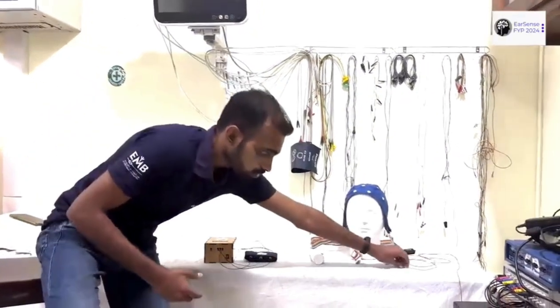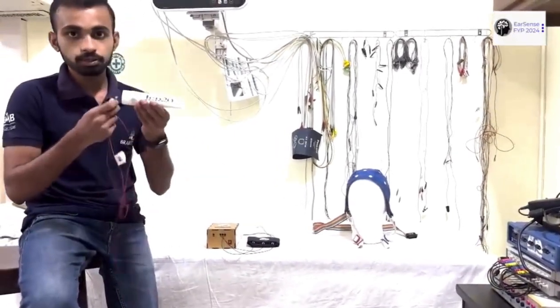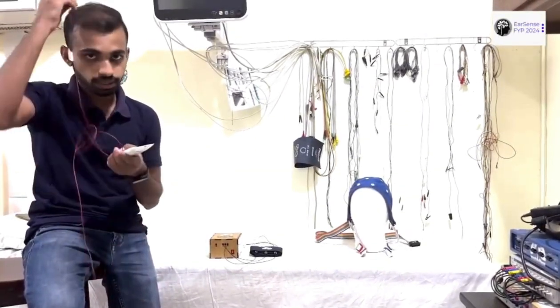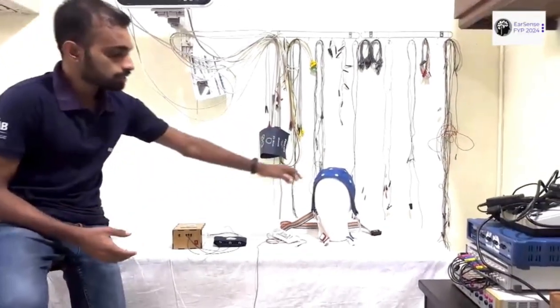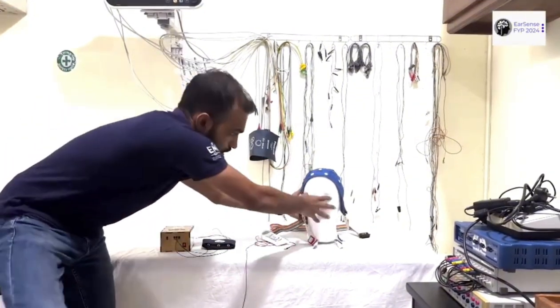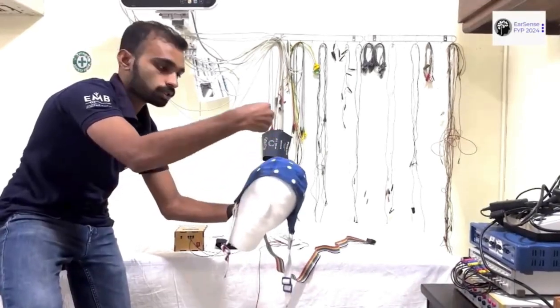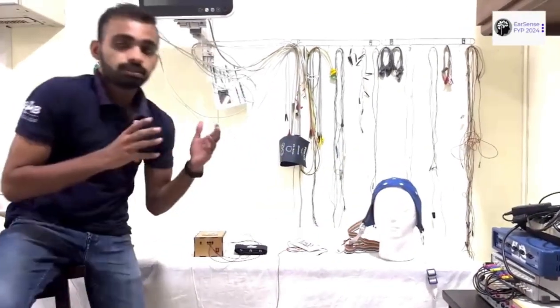Currently, EEG acquisition setups are very bulky. With a normal EEG setup, you have to use electrodes and apply conductive paste to them, so that you can establish a connection between the electrodes and the head. It is very hard to do, and people also use EEG caps to capture EEG signals. These caps also have a lot of electrodes, and you have to apply conductive paste to each of them. Therefore, these bulky setups are limiting the applications of EEG.